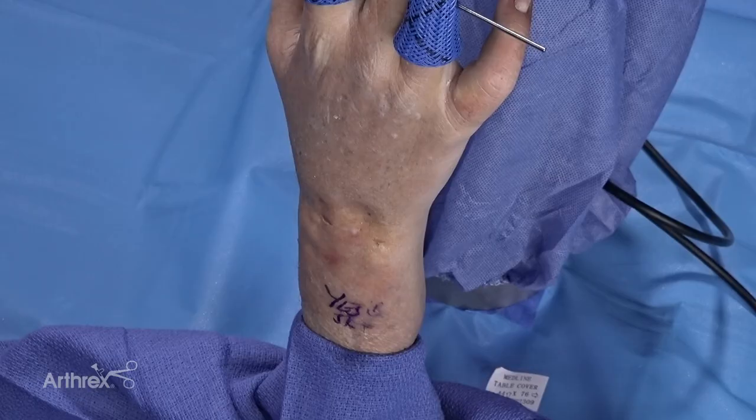Today we're performing a wrist arthroscopy. Not only can we do this in the operating room, but one of the beauties of this is that there's minimal kit needed, so we can move this into the procedure room for therapeutic modalities, or use it in the clinic for diagnosis and procedures such as intra-articular injections. But for today's purpose, we're going to be doing a wrist arthroscopy.